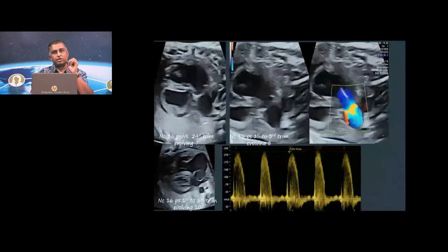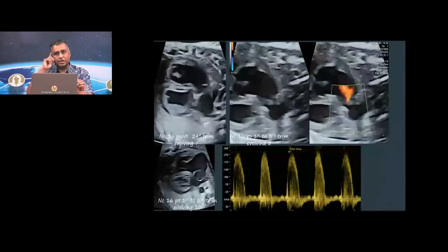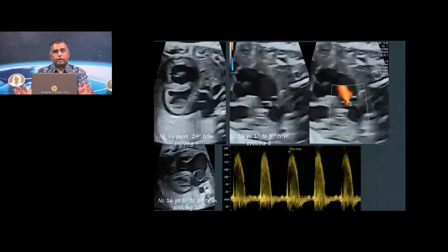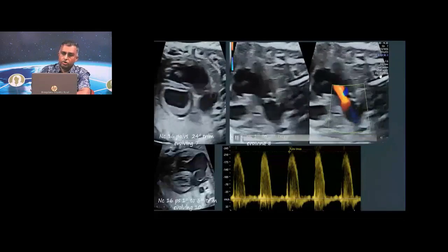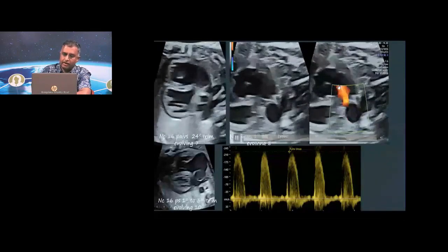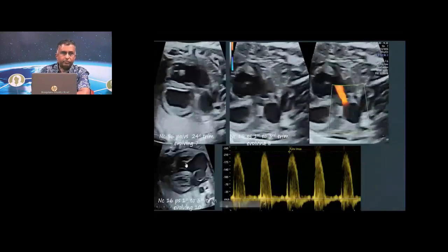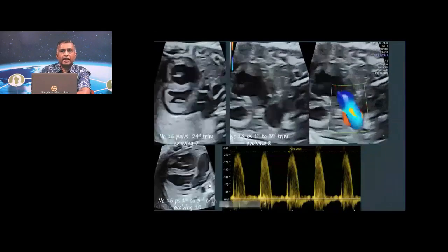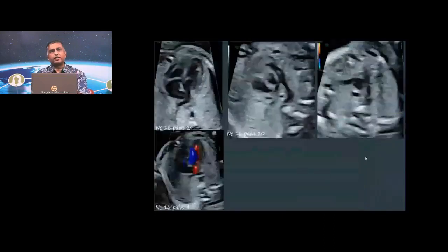And therefore, when there's a stenotic pathology, you will find that the aliasing which occurs draws your attention, telling you that there's a hemodynamic disturbance over here in terms of a stenosis. Also, you can recognize that there's a pulmonary regurgitation happening there, and that's the 4-chamber view, cardiomegaly, which you see over there, and that's the systolic jetting which you have. So all telling you that you're dealing with a critical pulmonary stenosis.